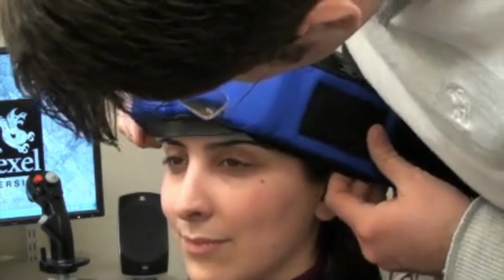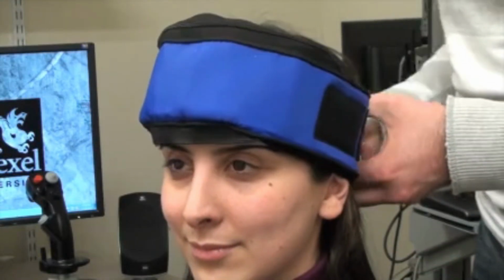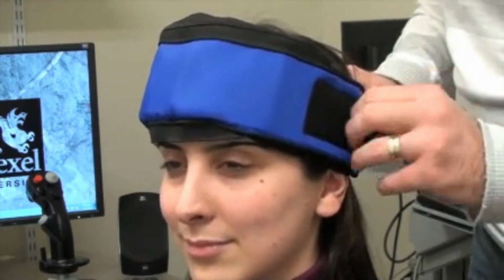Sometimes a headband, elastic and/or firm cloth, such as a tennis band or bandana, can be placed over the fNIR sensor to secure coupling of the optodes with the skin. After the sensor is positioned, signals at all channels should be verified by starting data acquisition.